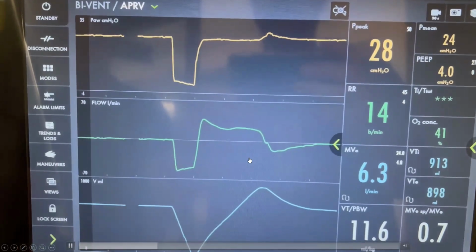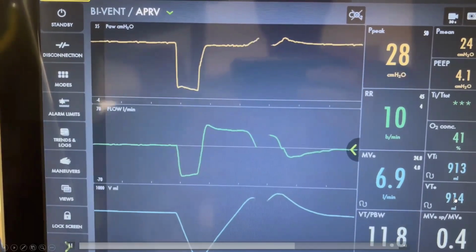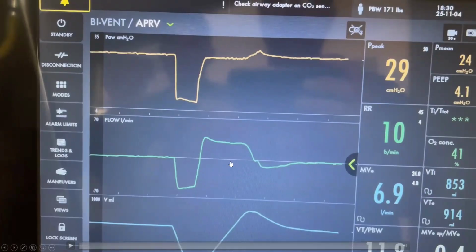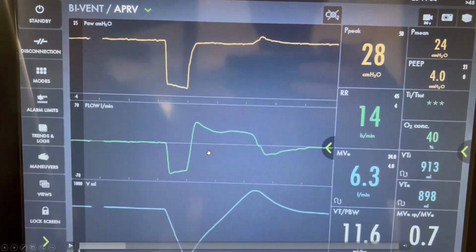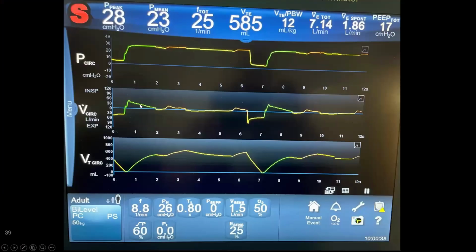Now here's a video of watching it too. And again, look at those volumes, they are 900 and 800. So again, keep an eye on those. There's another one that's interesting. Here's a 980. If you look at this one here, this is what the 980 would look like. So again, it looks like somebody's on about 20, 26.